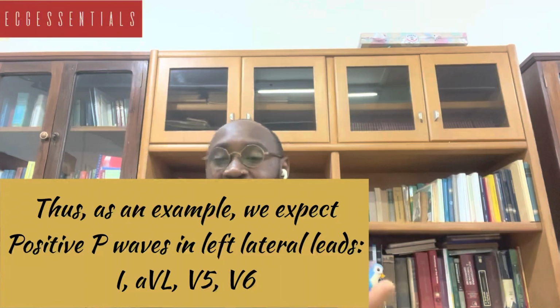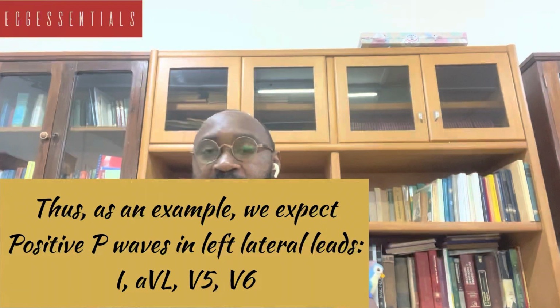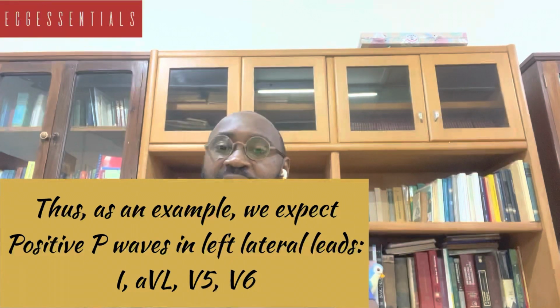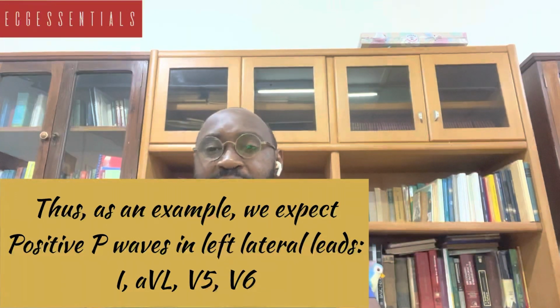So we have it that the left lateral and the inferior leads, remember the left lateral leads include leads 1, AVL, V5 and V6. Remember, AVL is minus 30 and lead 1 is 0 degrees.